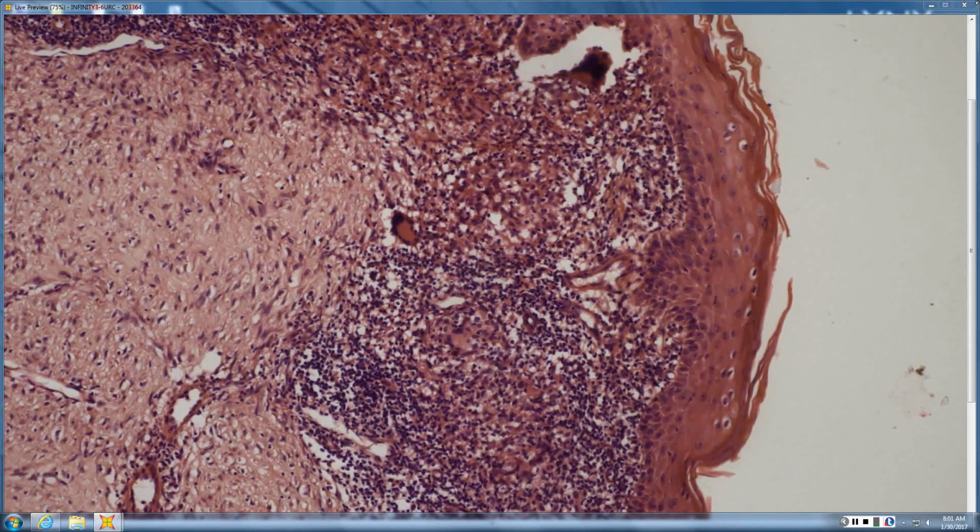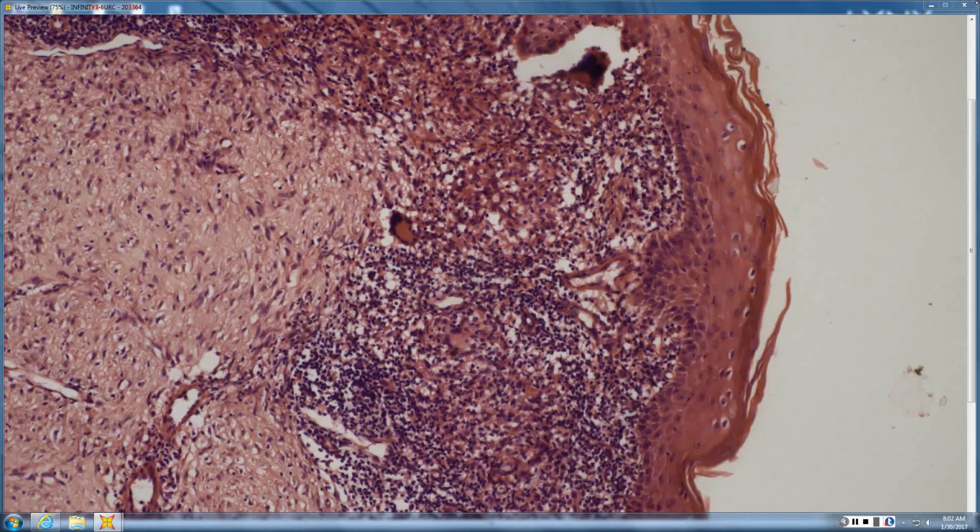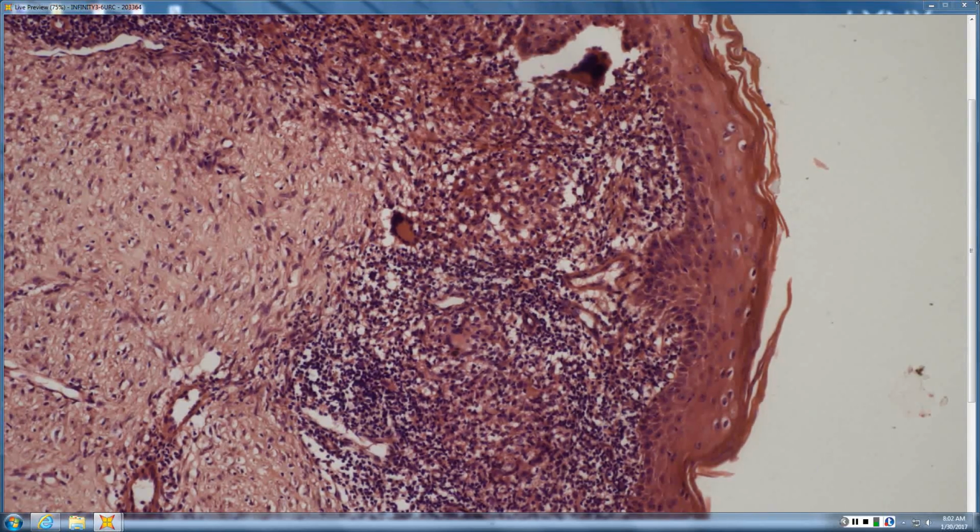So this is like the anti-sarcoid, right? Sarcoid would be granulomas in the absence of lymphocytes. Naked granulomas, these are like winter coat granulomas. They're not just dressed, they have extra layers of lymphocytes, right? So this is a heavily, heavily dressed granuloma with lots of lymphs.